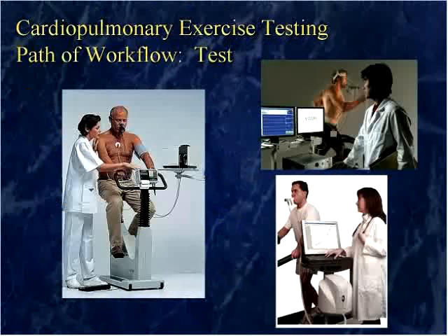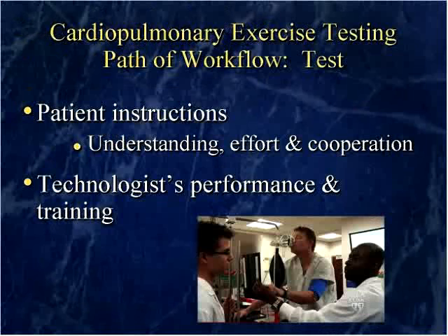Now during the test itself, there are other things that influence the quality of the test. Those are, does the patient understand the instructions? Do they understand the kind of effort and cooperation that is needed to give us their best effort? And so you really need to spend some time when you're introducing the test telling them that we're going to monitor you, that you're going to be completely safe, that we want you to give your best effort, we want you to go as far as you possibly can. If there's any reason to stop the test, we'll tell you to do so and cool down. But other than that, we want you to give your best effort, and you need to encourage them to do that.